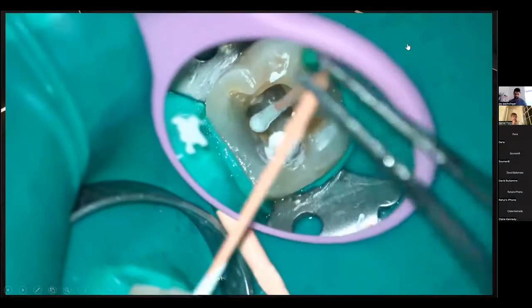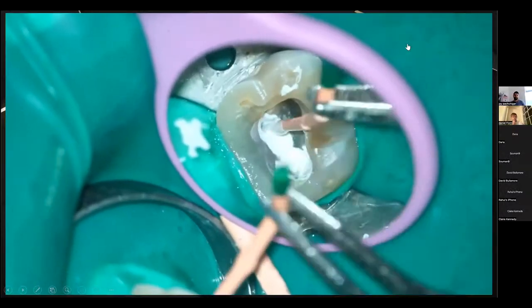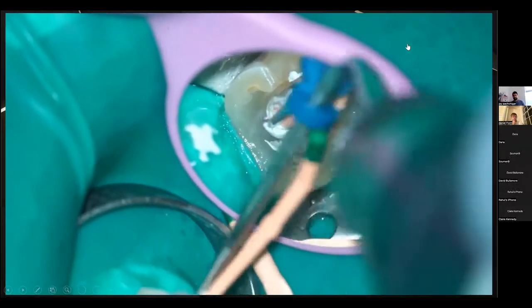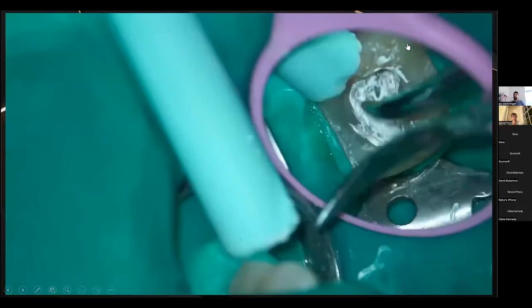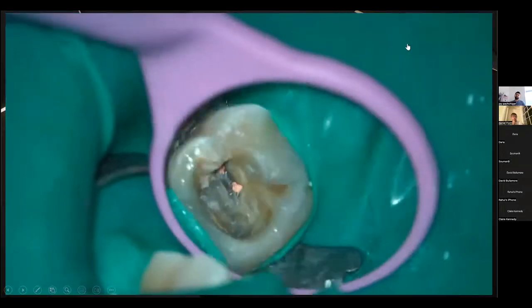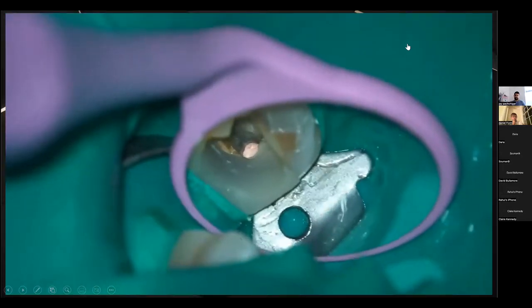With my heater, I've only gone in 1, maybe 2 mils into that canal. Just a bit of that gentle down pack. You don't really need to be doing anything too vigorous there. Same in the distal here, probably 3-4 times, pressing that sealer into the apical regions of that canal. Again, very easy to clean up over here as well. And this was the result that we got.